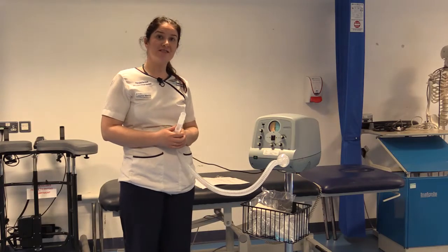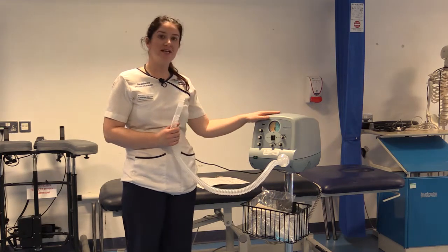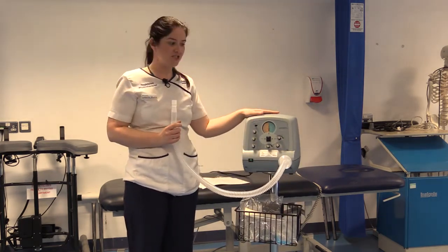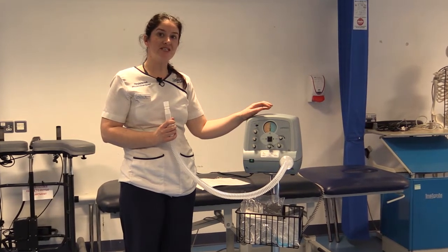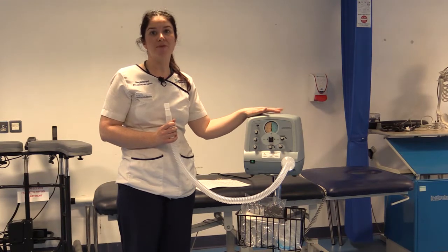I'm going to talk about the cough assist machines and go through two of them. The first one is known as the Emerson cough assist machine. This is the older style cough assist machine, which you can't entrain oxygen through, so you need to decide with your patient whether this machine is suitable. If the patient is on high oxygen requirements, it may not be the cough assist of choice.